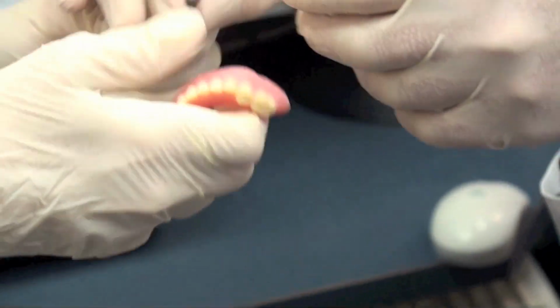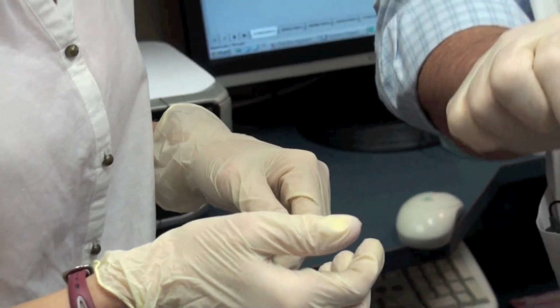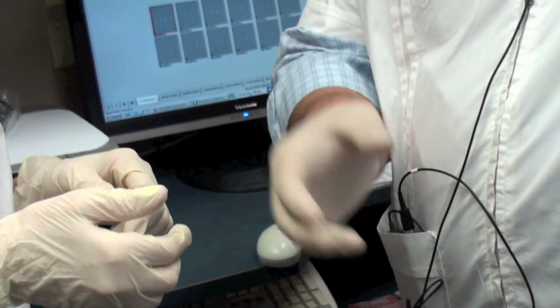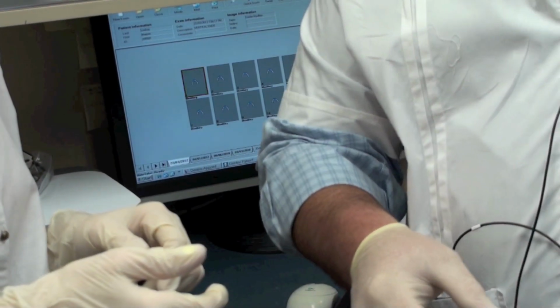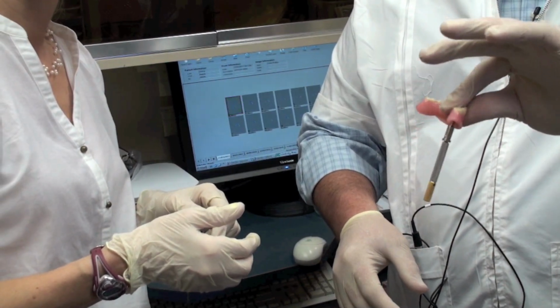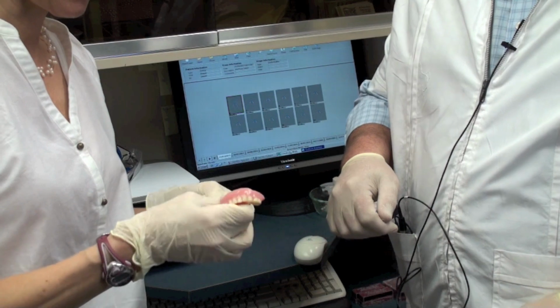Okay. It's not that easy. No, but what you want, I'll do this one. But when you go in, you push it in like that. So see how it's held in now? Yeah. So then when you go to pull it out, it's going to grab it just like a locator would. But you need to have it sitting like that, so when you have it in, it's attached in by itself. So now try to pull it straight out. Oh, that's easy. Okay.